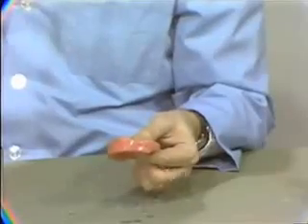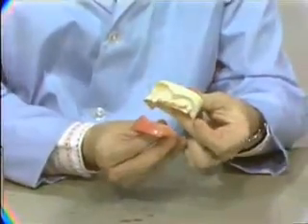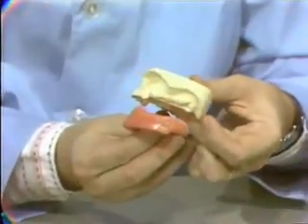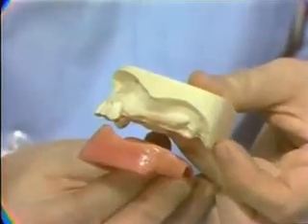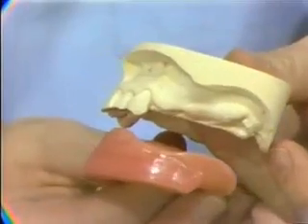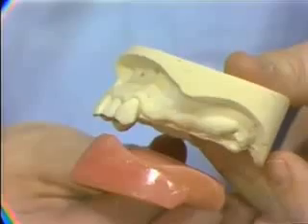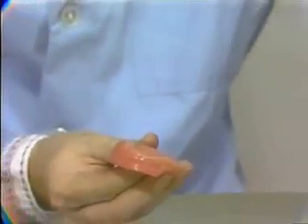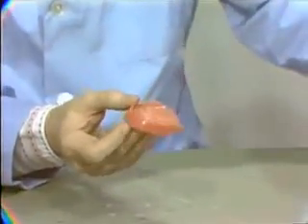Okay, I have also a model, actually it's an immediate denture master cast, where we're looking at natural teeth in connection with the partially dentulous ridge, and you can see the same configuration. Okay, so that should give you an idea of why we have this wax posed labially. And again, it's different with every patient, and the inclination is actually formed in the mouth until we are sure that the lip support is what we want. The way the teeth will eventually support the lip.